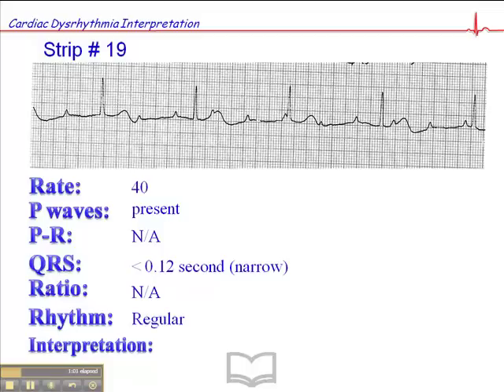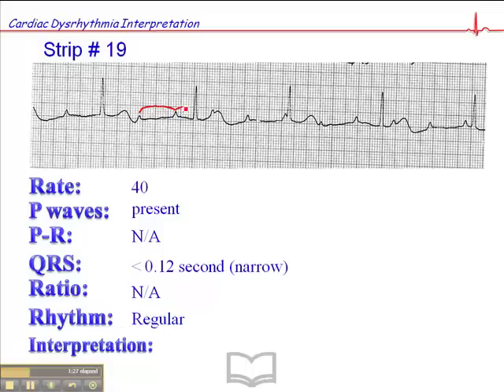The rhythm is regular, which suggests that these QRS complexes are coming from the same focus. But this is odd because there are P waves present but there is no consistent PR interval. The P waves don't appear to be connected in any way to the QRS complexes. And in fact, if we were to map them out, we would see that they're equidistant, and there's a key finding here.